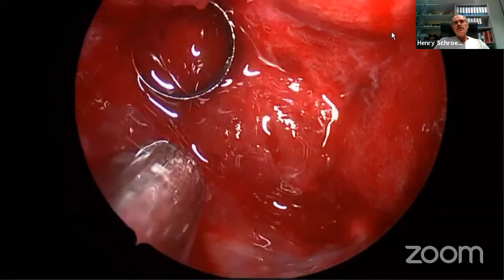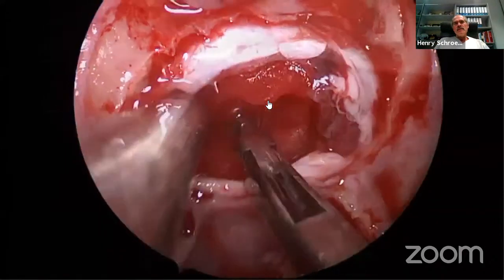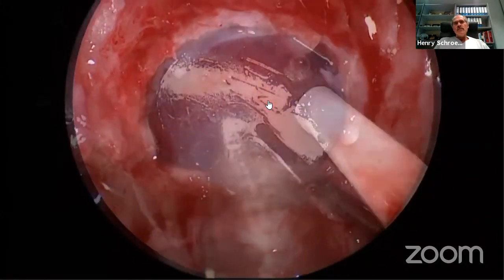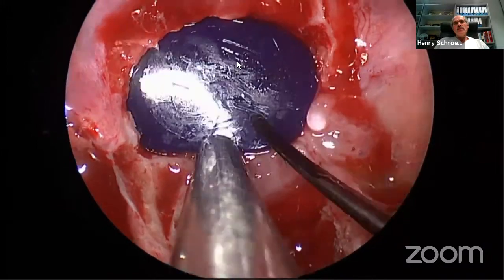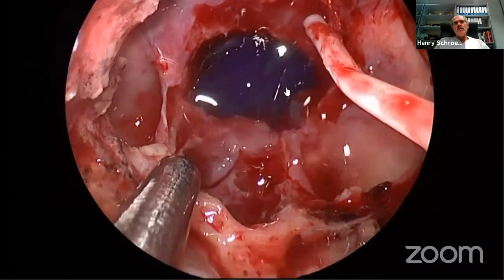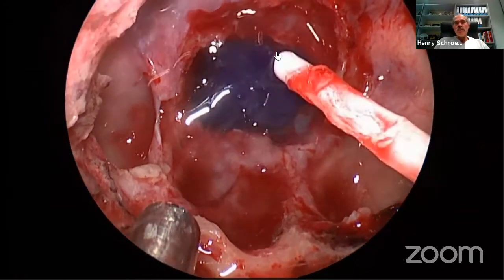When you look inside, you see it's only gland. Then we put some gel foam inside. Some fibrin glue can be used. And then we put this resorbable plate and wedge it against the bony margin. We don't always use fibrin glue if there is no CSF leakage, but we had it open already on the table. Otherwise, you don't need it.